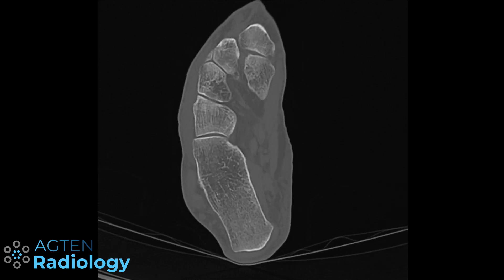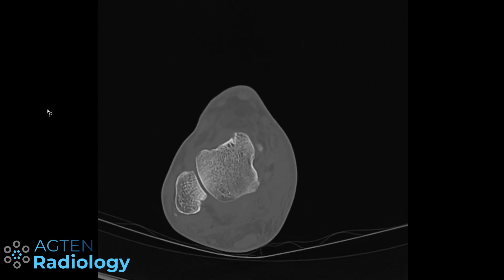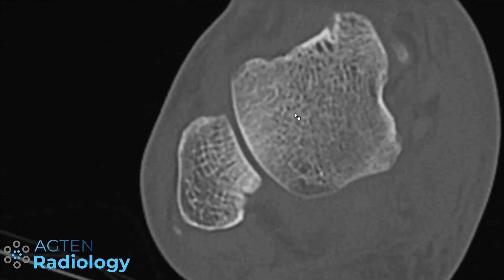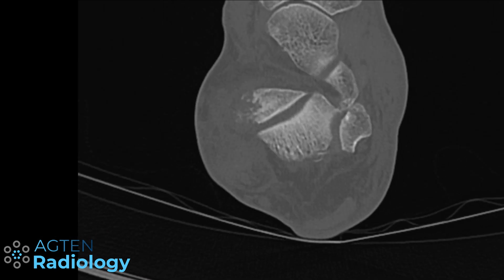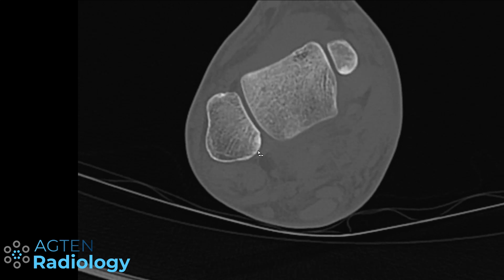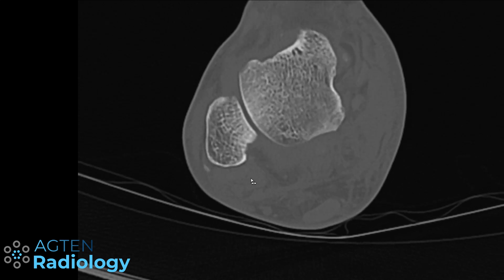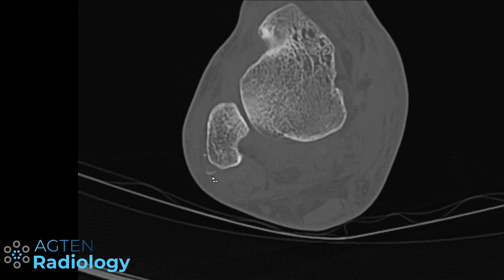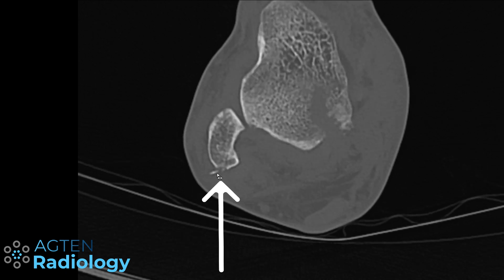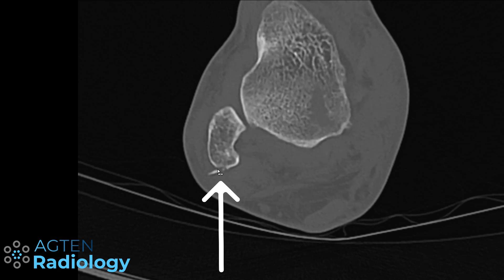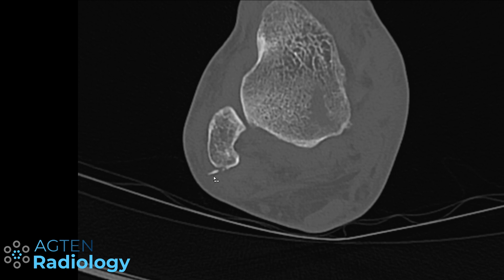So, peroneal tendons. Starting proximally, we can see at the level of the peroneal tendons there is a subtle calcification and a cortical fragment which would belong down here. This is already an indication that something is going on in this region. This is a cortical avulsion of the superior peroneal retinaculum, which on radiographs is also sometimes visible and called the fleck sign.